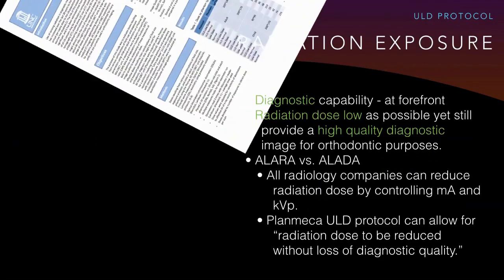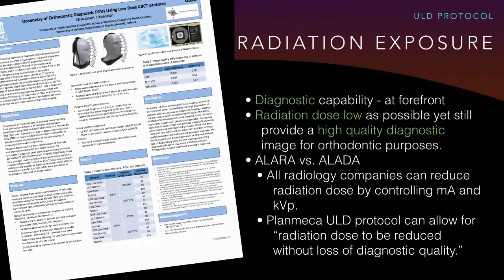Regarding radiation exposure and ultra-low dose protocol, what we have to remember as orthodontists that are going to be using this technology to treat our patients is that the diagnostic capability of the images must be kept at the forefront of the discussion. Because like I said, anybody can lower the radiation dose.